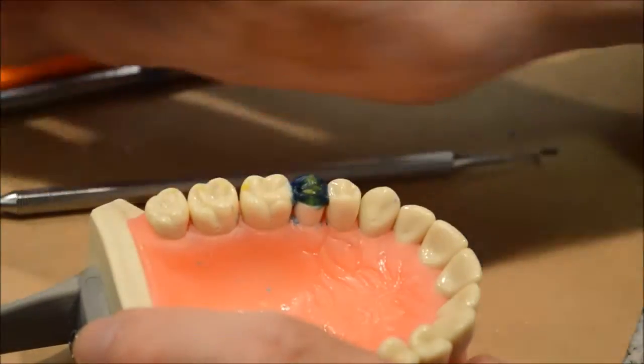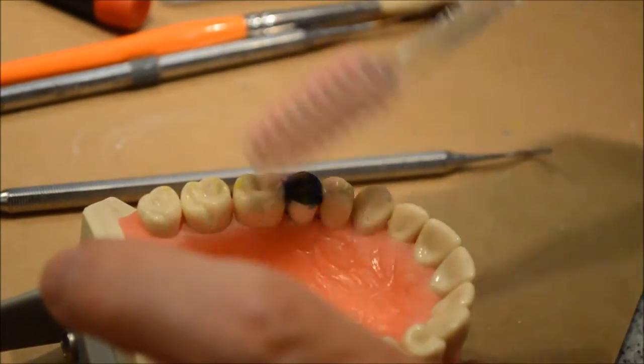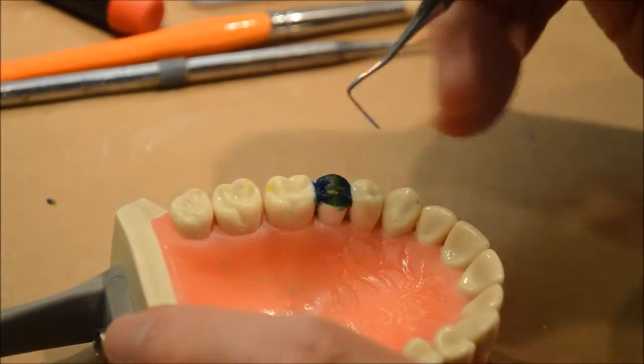We like to have you make sure that you're working in a neat area, so if you get a lot of little pieces of wax you've got to clean it up.